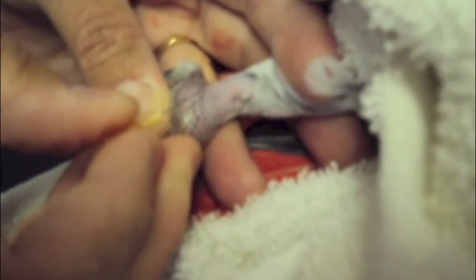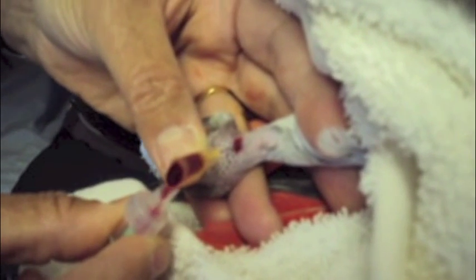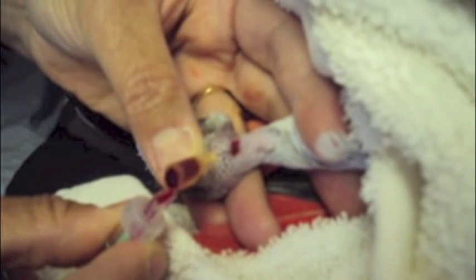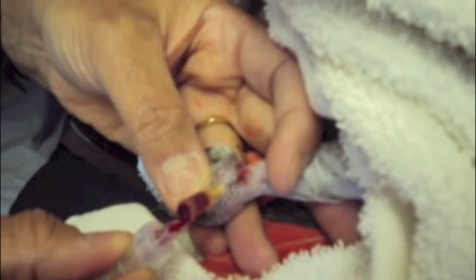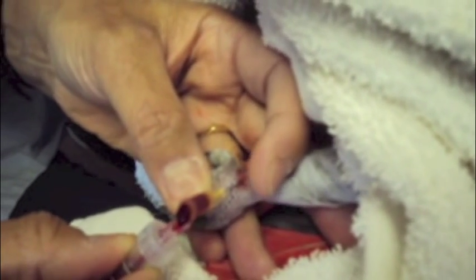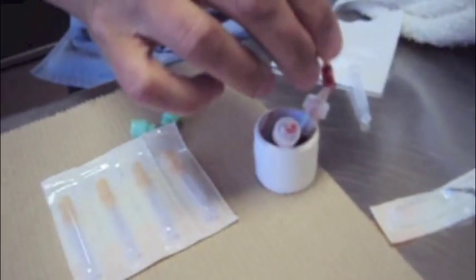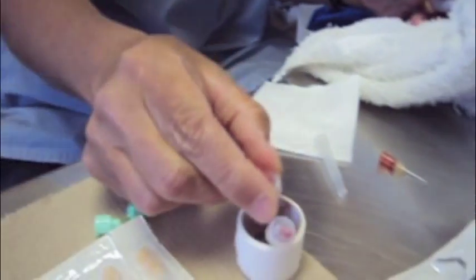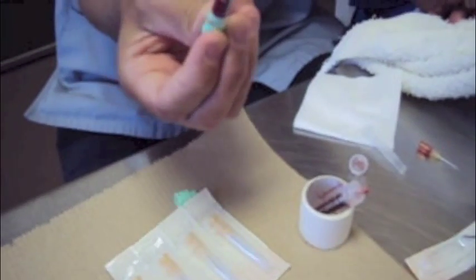The blood is just going to flow right through the needle into my microtainer tube. I'll show you at normal speed what it looks like. The bird is tolerating this quite well, and I need about 10 to 14 drops of blood to fill up my tube, which gives me about 0.3 ml. I block it there while I change my tubes to recuperate every drop. Normally I can take about one percent of the bird's body weight in grams — so for a 300 gram bird I could take up to 3 ml, and this is 0.3 ml per tube, so 0.6 ml total, which the bird can tolerate very well. It's best to get the sample between the bottom and upper line of the tube to prevent the sample from being overly diluted. I cap it off and do slow inversions to mix it well.